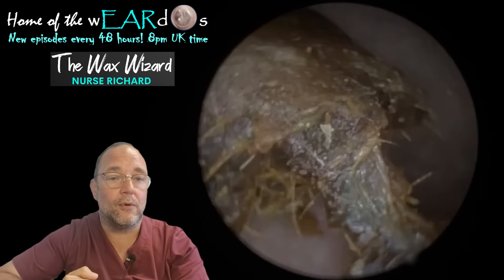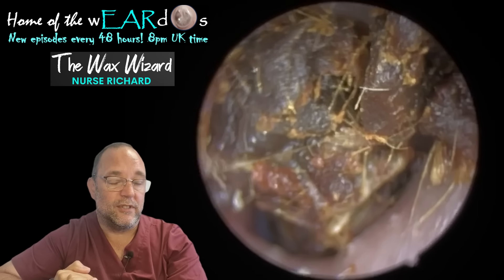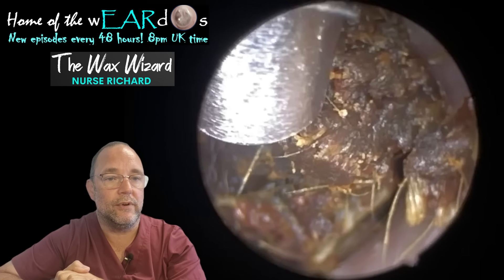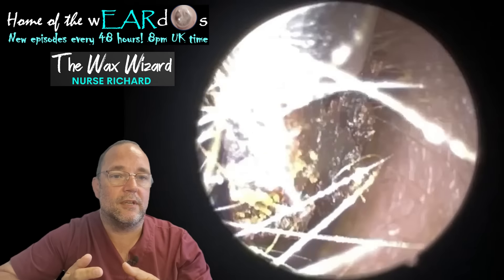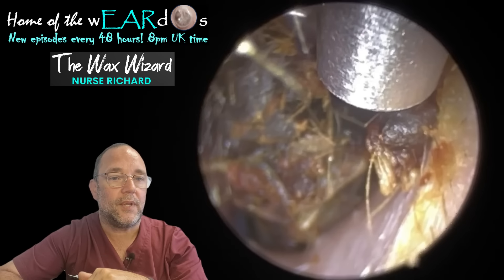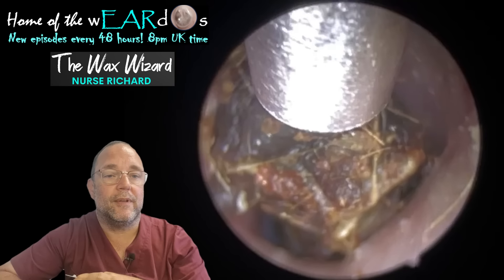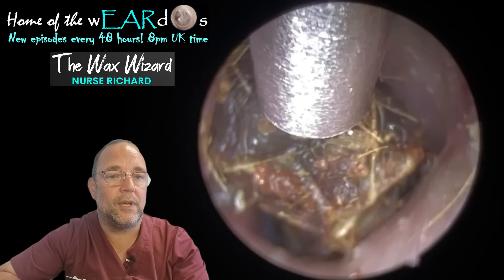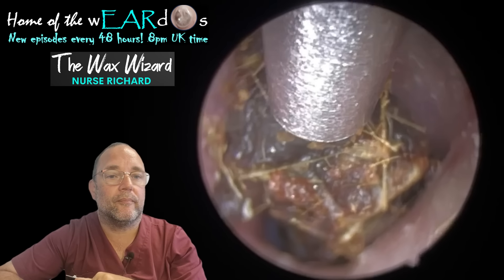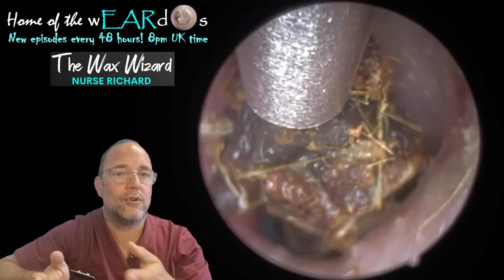I explained to him, 'I can go and get those if you want, but that comes with some risks and it's definitely not going to make any difference to your hearing.' Obviously there's a sharp metal object in your ear. I said, if you want my opinion, not really worth it. Just put a couple of squirts of oil in — it'll probably loosen it and then it'll naturally migrate out. He said, 'Do you know what, I'll just leave them there then.' That's absolutely fine — so it's an informed decision. I explained what the risks were — puncture of the eardrum, graze the ear canal — and then let the patient make that decision. I probably wouldn't have done it anyway even if he'd said yes — I was trying to lead him in that direction.